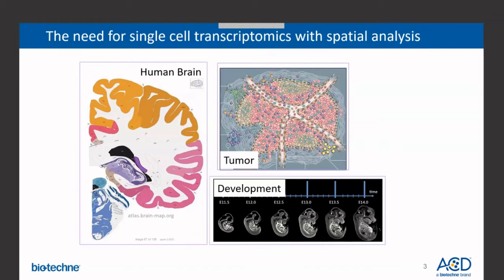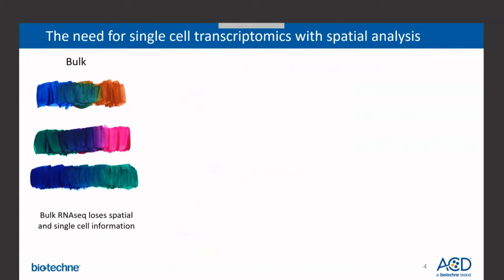But with such grind and bind assays, you lose a lot of information. The analogy here would be there are several different colors of paint you can combine and still end up with the same color at the end of the day. But just looking at a particular hue, you don't know precisely how much of or which exact colors were mixed together.